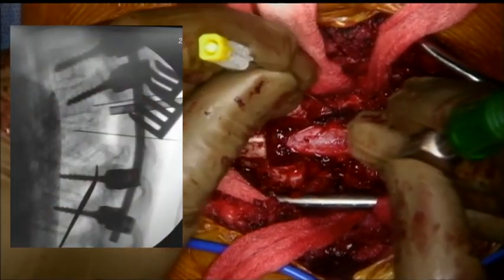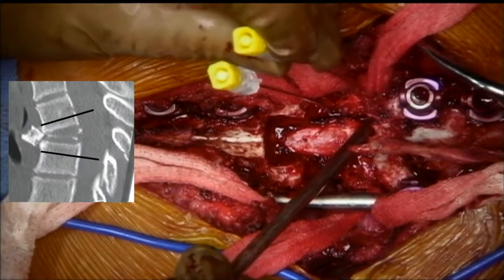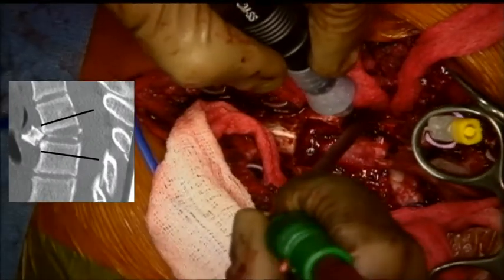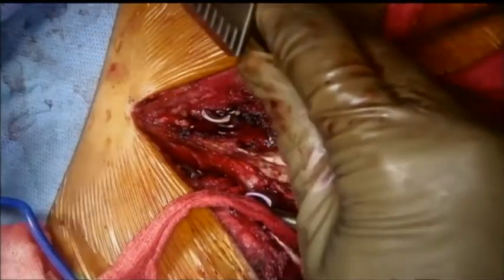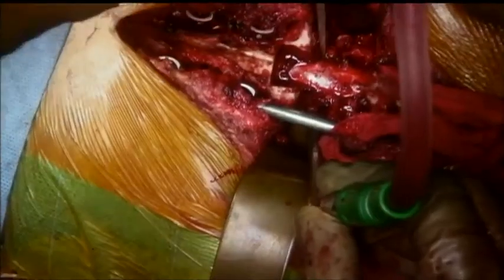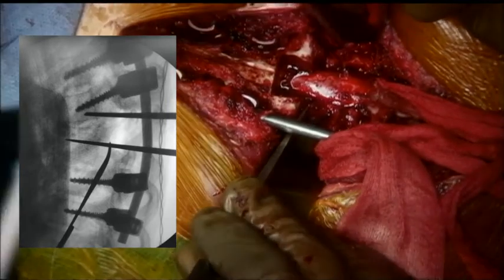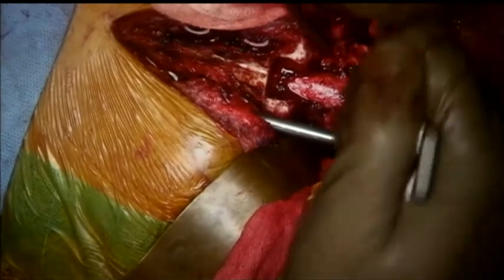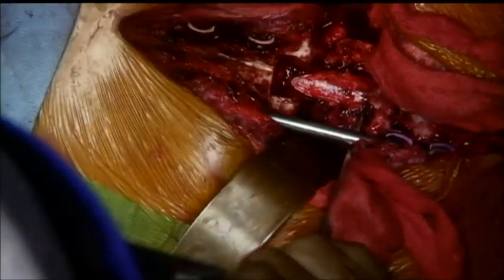Using a spinal needle, we determine the level of the osteotomy on fluoroscopy. Our plan was not to get into the disc but to drive the cut through normal vertebral bodies above and below. Using a bone scalpel, the initial cuts are made and then extended using osteotomes. The direction and depth are checked repeatedly on the C-arm. The inferior cut is made through the upper part of the T6 vertebral body, taking care not to go through and through at this stage. Similarly, the upper cut is made through the lower part of the T4 vertebral body. Malleable retractors are placed around the spine to protect the anterior structures in case the osteotomes inadvertently slip out.